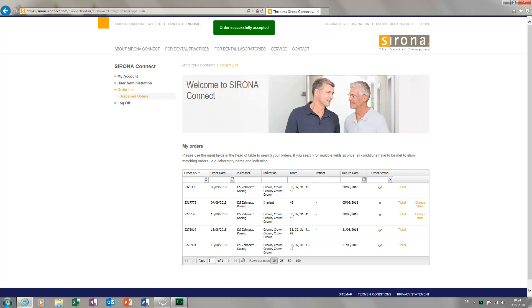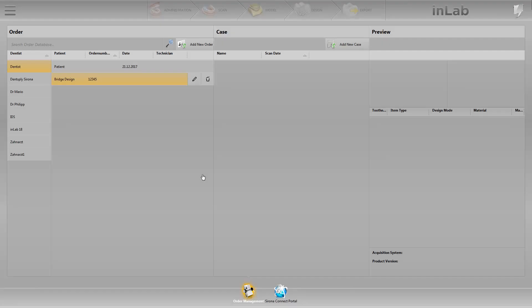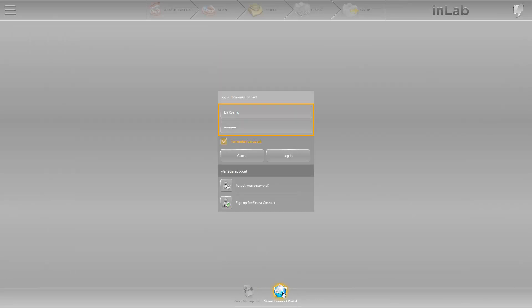Alternatively, instead of directly accepting the case and confirming it in the Sirona Connect portal, you can also check the model data before accepting the order. Let's assume you have received an email notification that the dental clinic has sent you an order. First, you open your INLAB software and make sure that you are connected to the internet. Then, you click the Sirona Connect portal icon on the bottom edge of the screen.